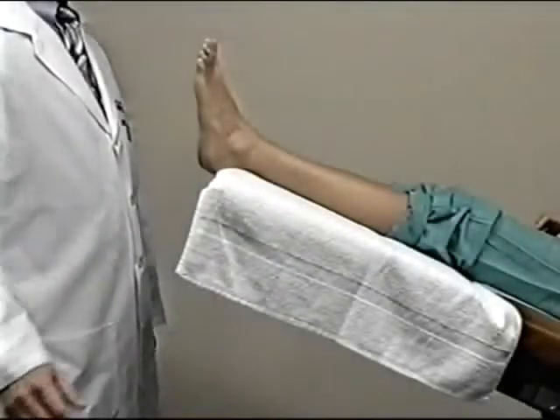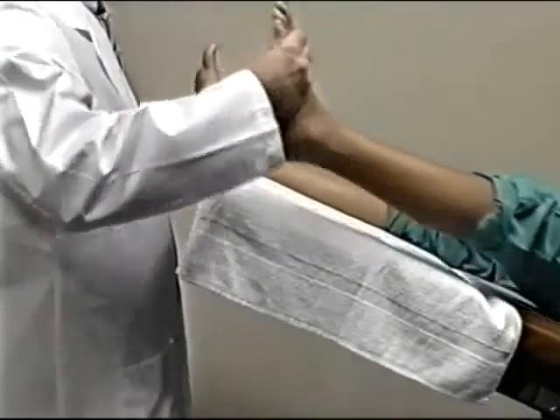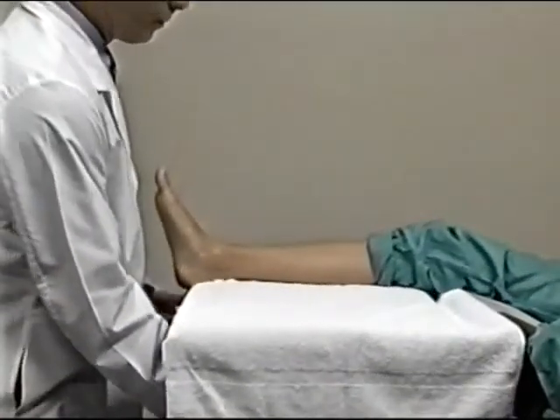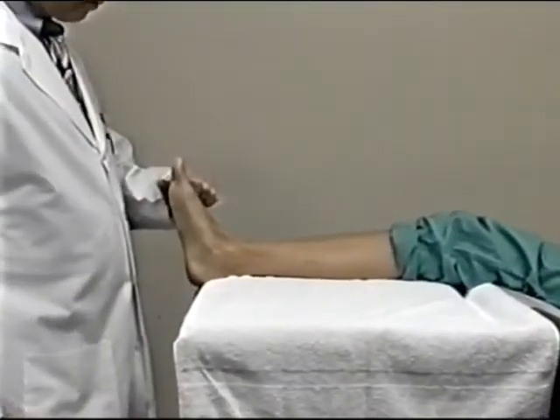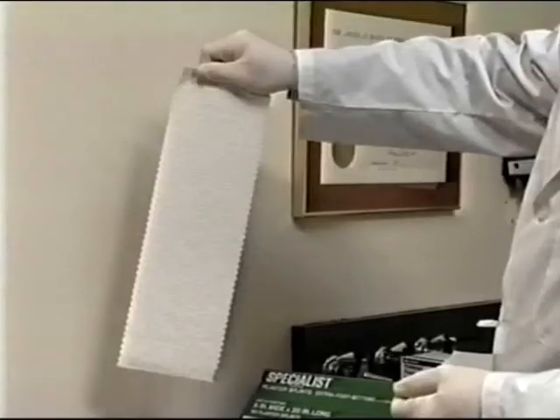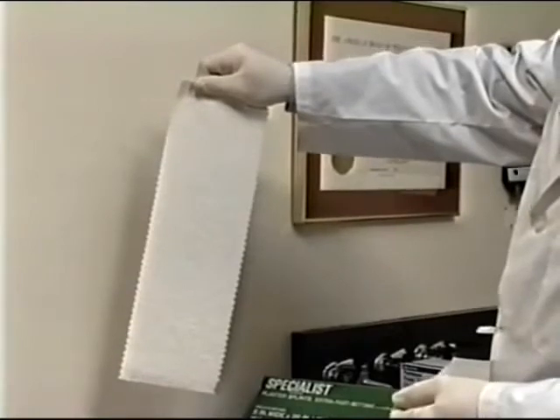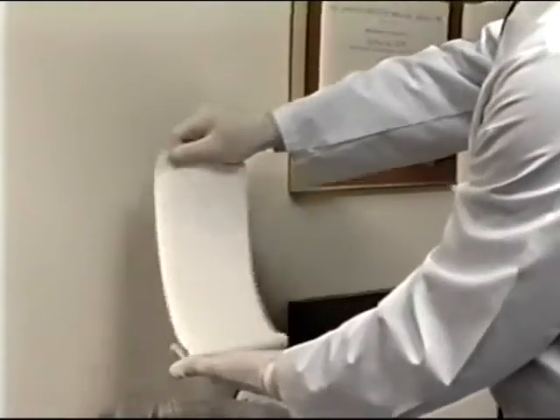This videotape has demonstrated a negative casting technique for the construction of a functional orthotic. The patient should be in a comfortable position with the knees bent and the foot vertical. The materials used are two plaster of Paris splints, cold water in a plastic-lined bucket, and gloves.